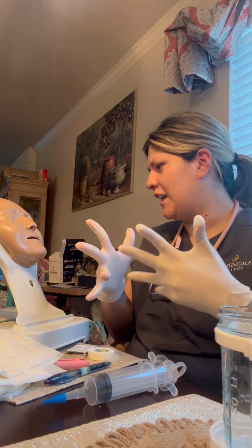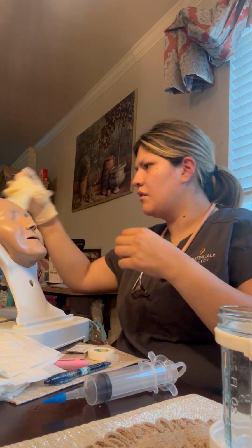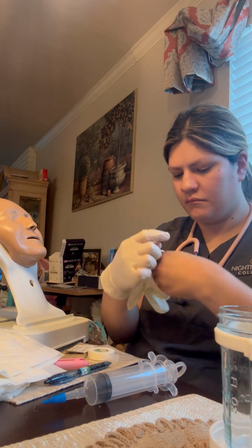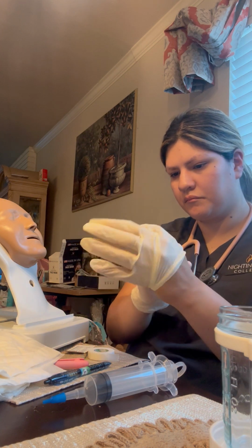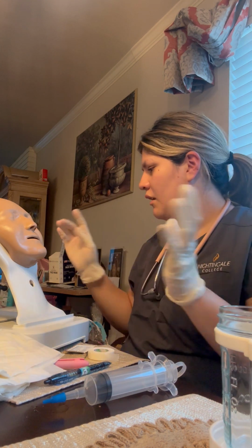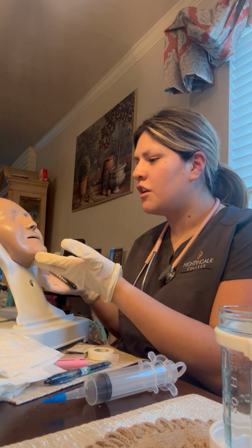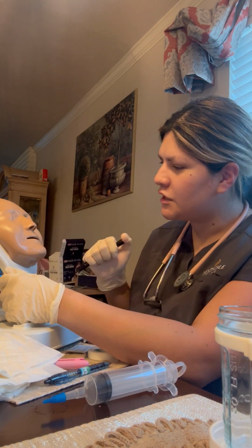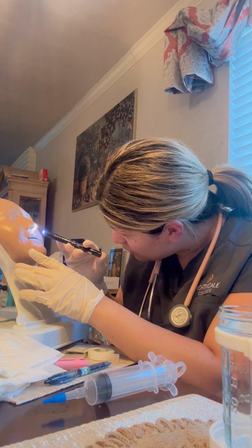Sorry, it's a little tight. Okay, I'm going to take my pen light, and I'm going to have John go ahead and tilt a little bit back. I'm just going to check your nasal passage.